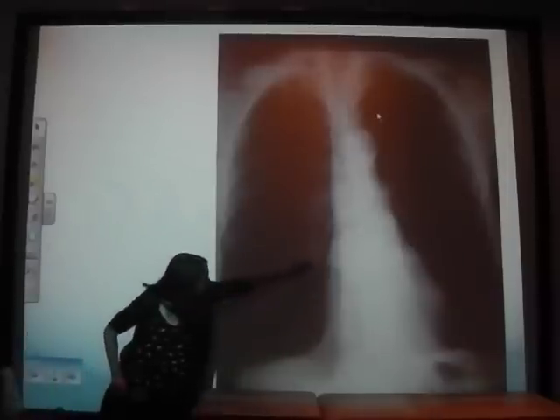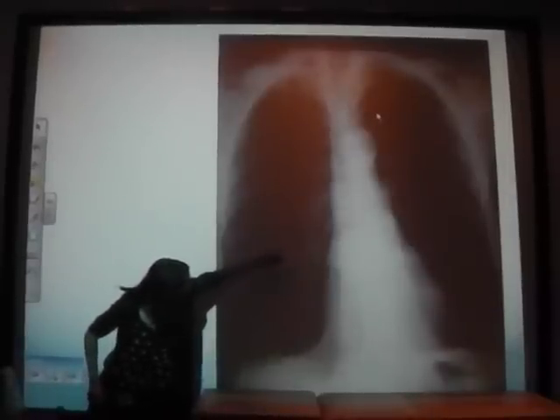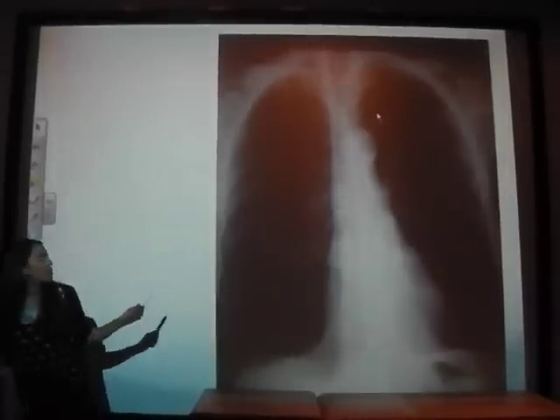This patient, why do you say it's got a lower lobe collapse? Can you see that? I don't think it's projecting very well on there. He's got a flattened diaphragm, but it's actually a right lower lobe collapse. You're looking at the heart border. Is there left as well? Because there's a double heart border on the left hand side, so some sort of left collapse.